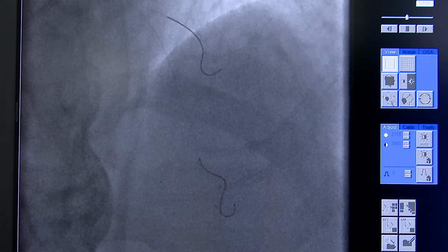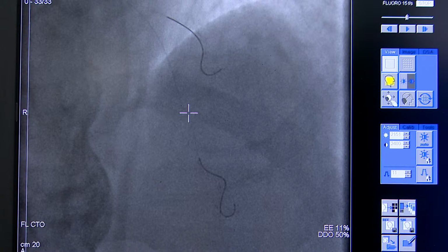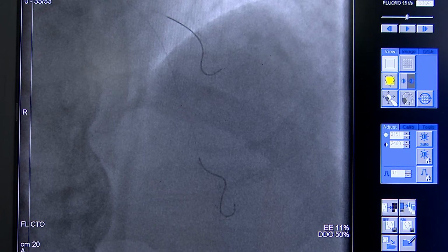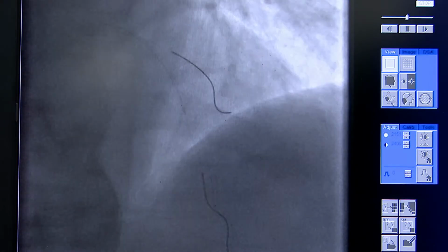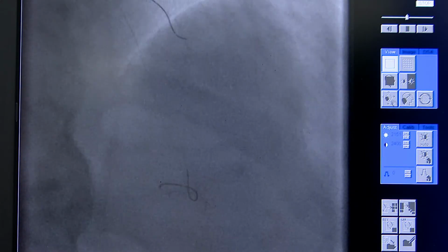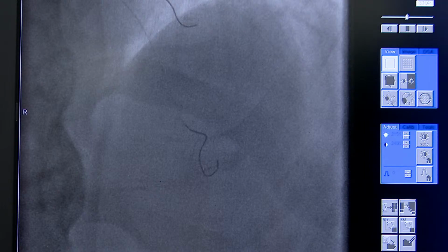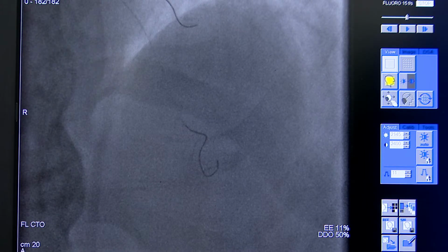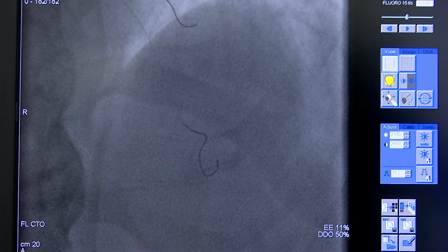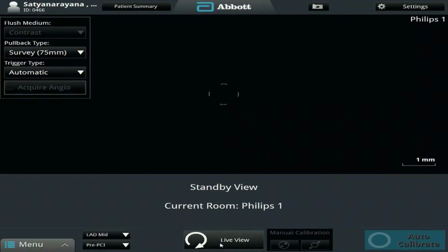Remove the balloon so that you can place it nicely. And push. Otherwise, I will put it. No, I think some wire shape might have gone. Put this one darker. Put it darker. Leave it. I will do it. Yeah, brother.